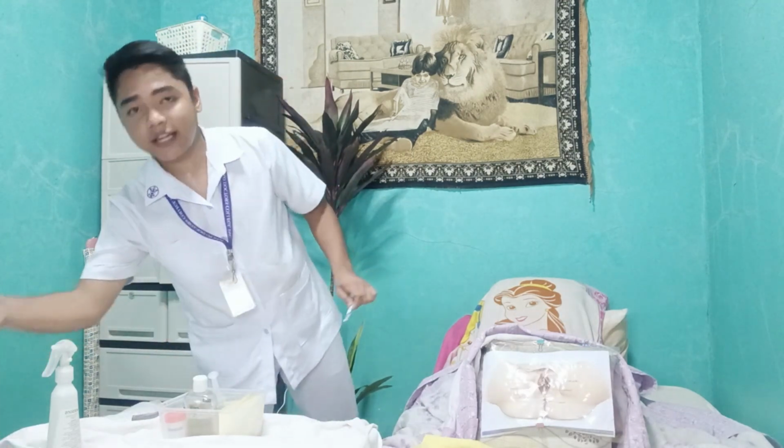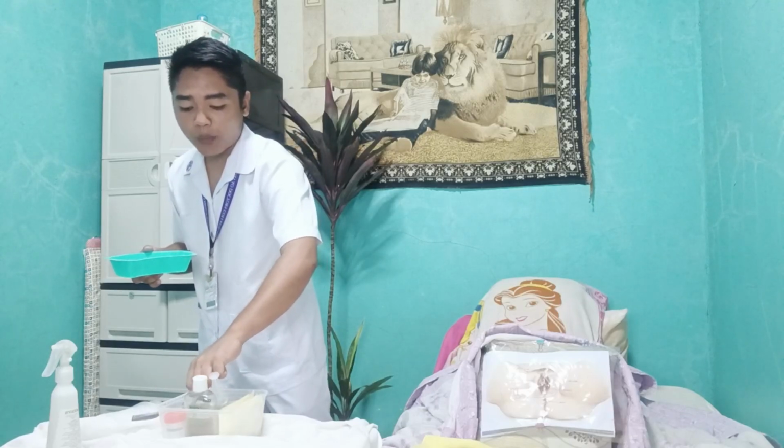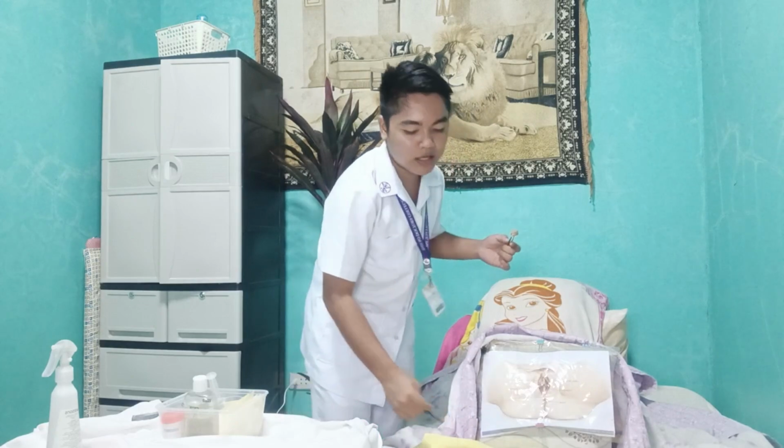Okay, so after doing that, I am going to use my sterile forceps to pick up some cotton balls, soak them in a cleansing solution or betadine, and clean the genital area of the patient. Now, this is the other forceps. And we should not forget our kidney basin so that we can throw our contaminated cotton swabs into it. So let's place it on the bed pad. Now, thorough cleansing of the meatus and the area surrounding it reduces possible introduction of microorganisms into the bladder.